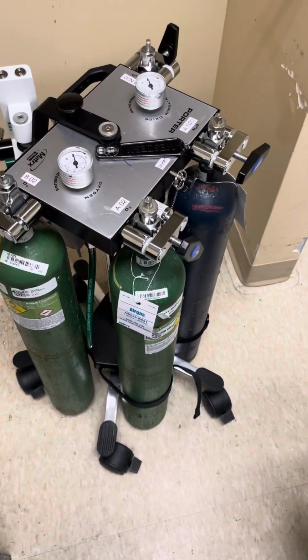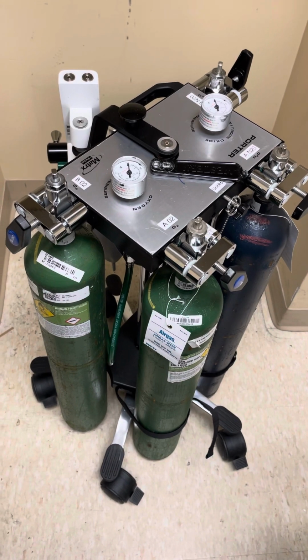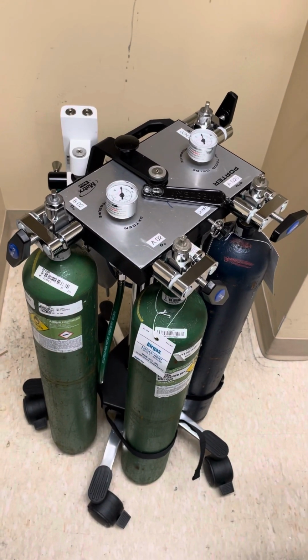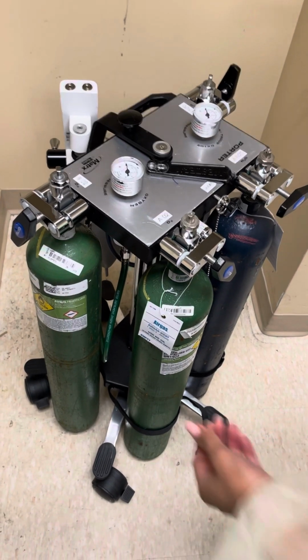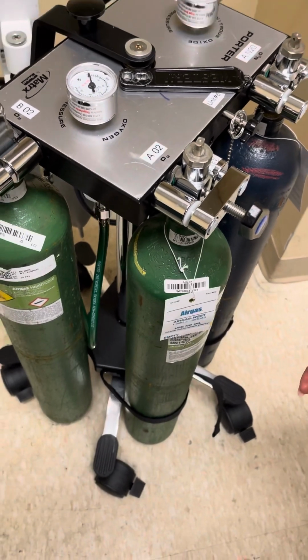Alrighty, to change a nitrous tank or an oxygen tank, you must be with an instructor or one of the dentists, and they will let you know if you can come in and change a tank. The first thing you do is make sure that you rip the tag to show that the tank is empty, so no one else gets an empty tank.